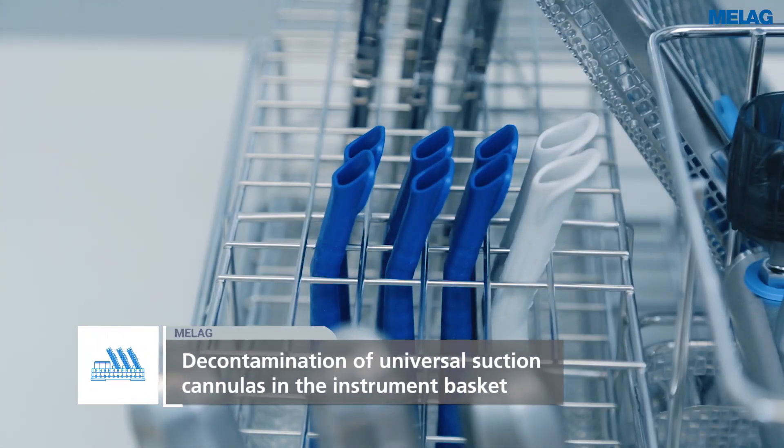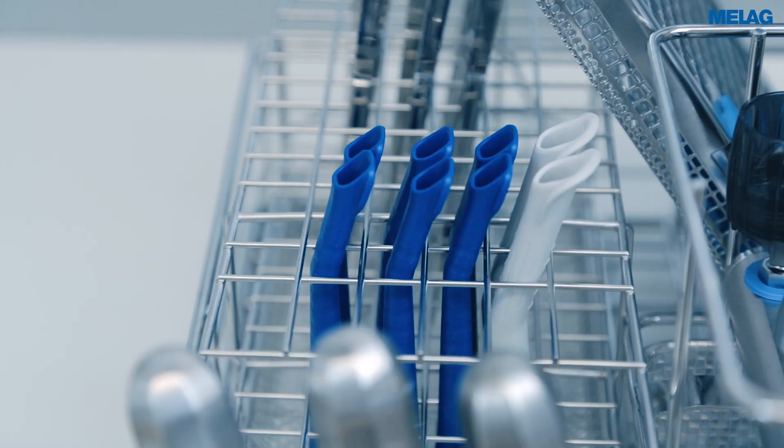Only the Mieleferm 10 Evolution enables the decontamination of universal suction cannulas with a diameter of 11 to 16 mm standing in the instrument basket.